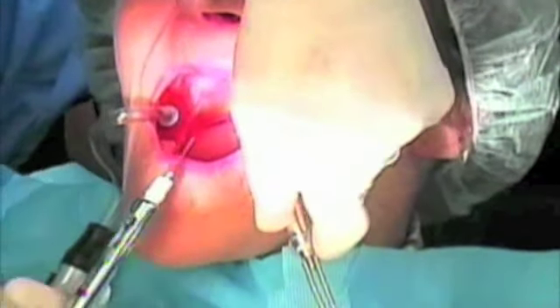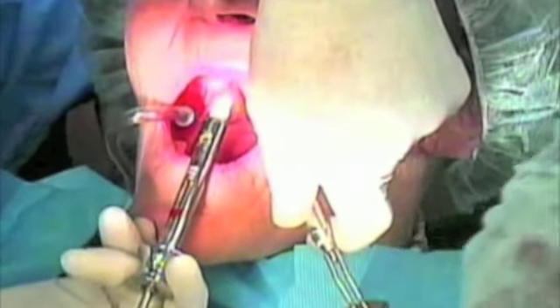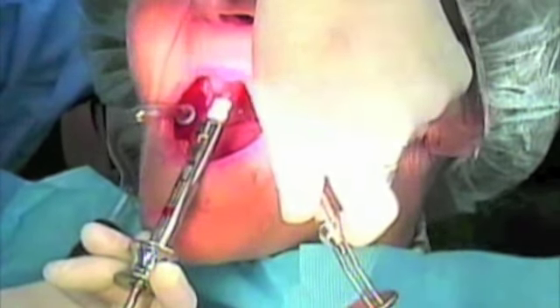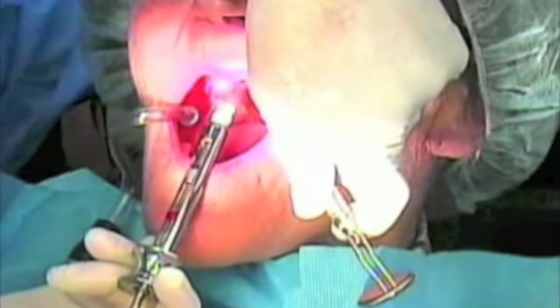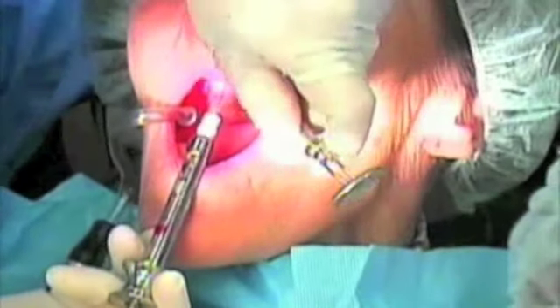Each planning process is unique and is based entirely upon specific considerations and prerequisites that are present for each individual patient. The implant sites have to be planned with a minimum distance from center to center, depending on which platform you are using.